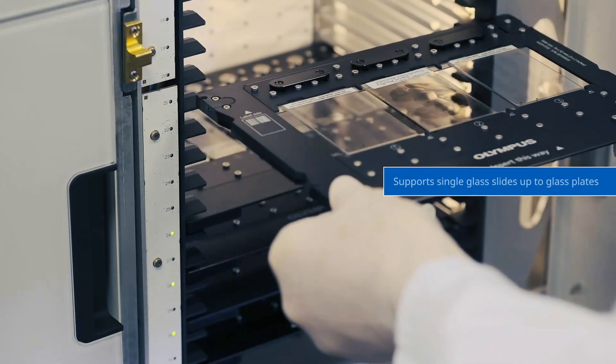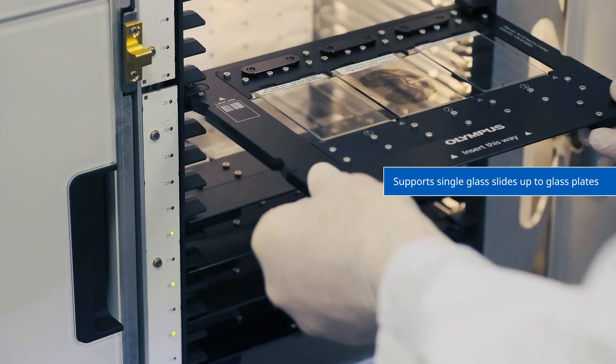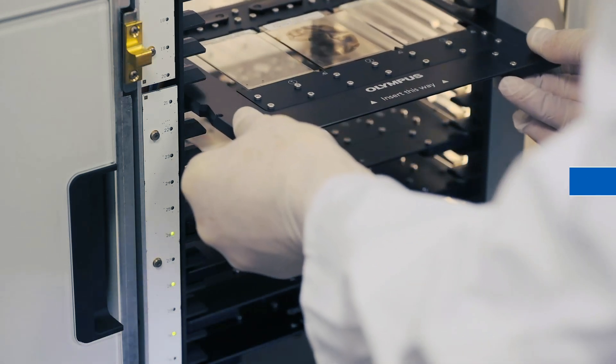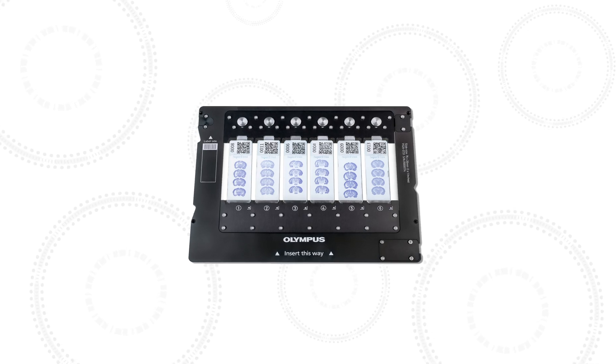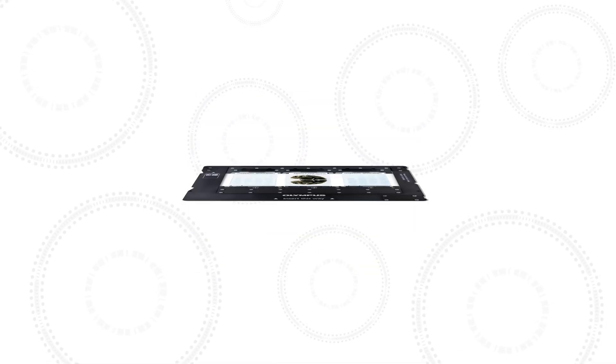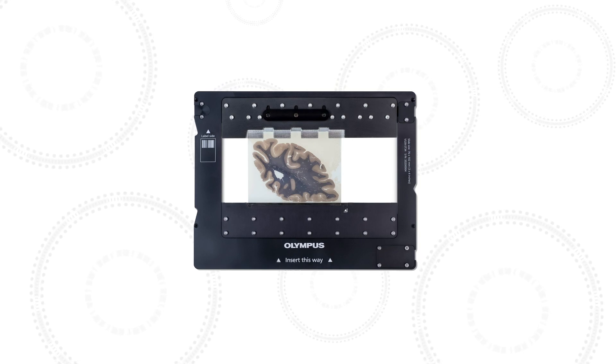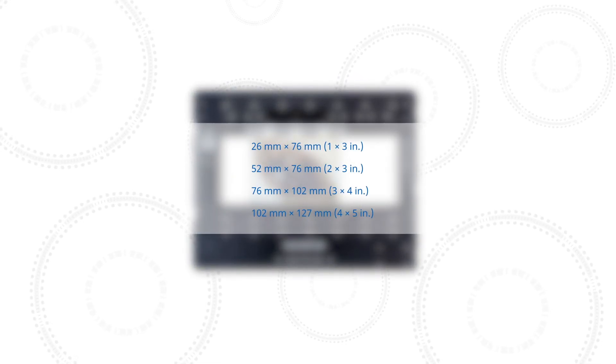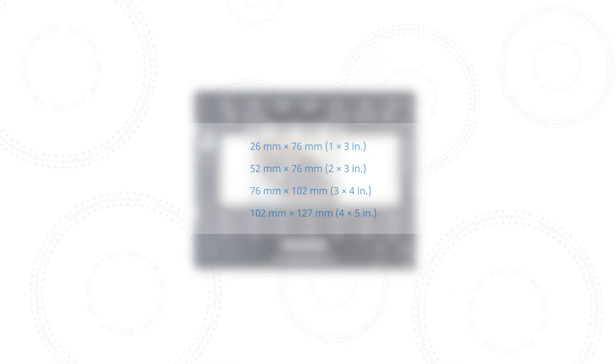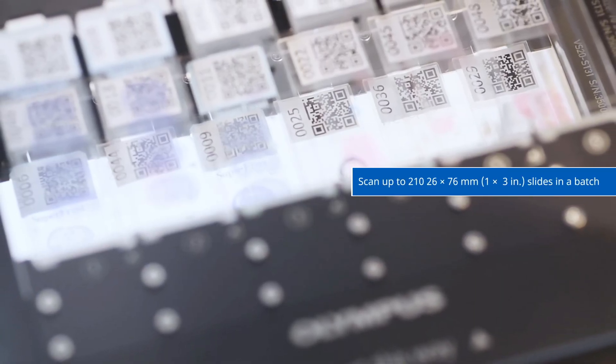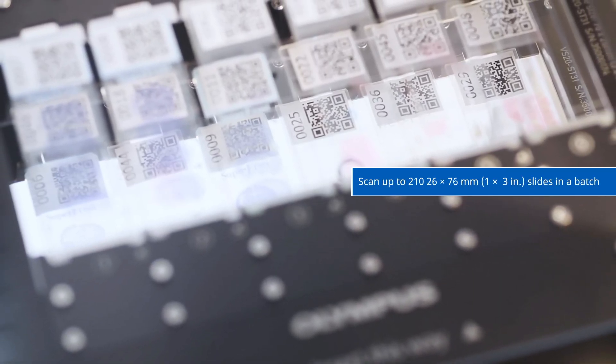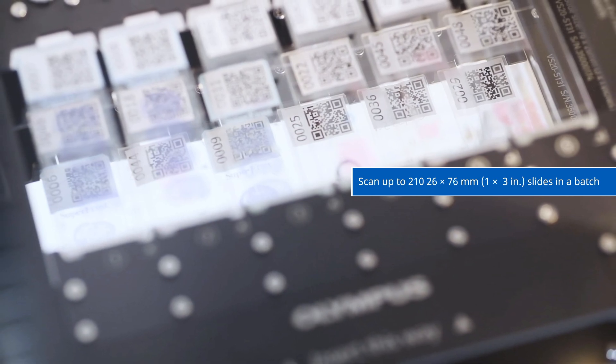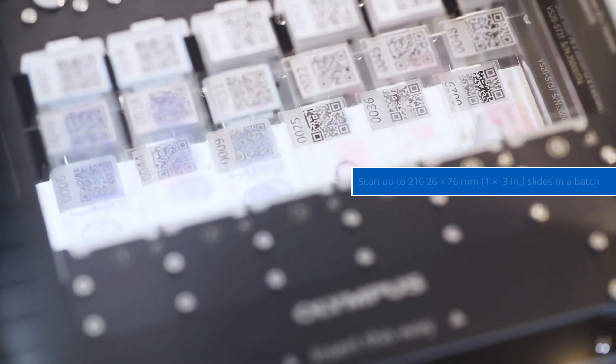The slide tray enables you to scan different sized slides in the same batch, including 26x76mm, 52x76mm, 76x102mm, and 102x127mm formats. Up to 210 26x76mm slides in 35 trays can be loaded at the same time.